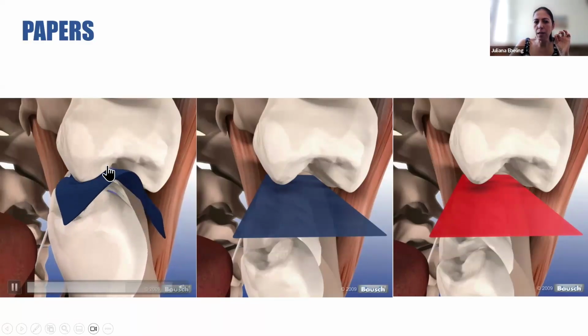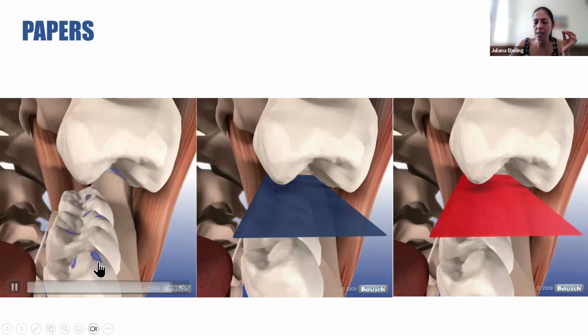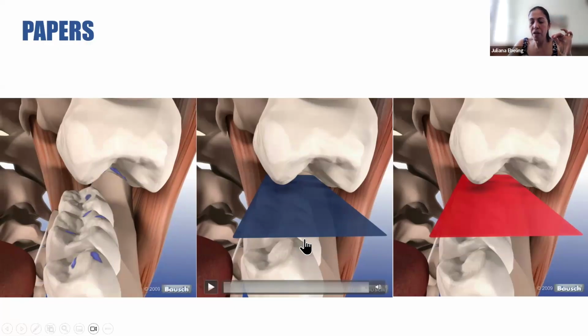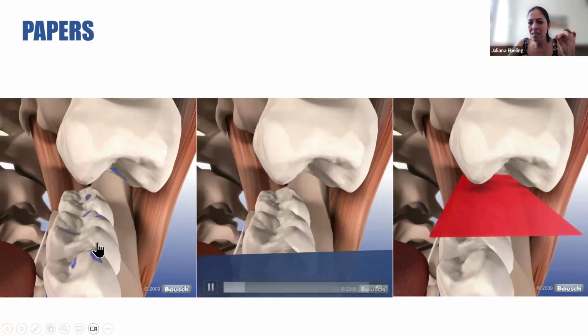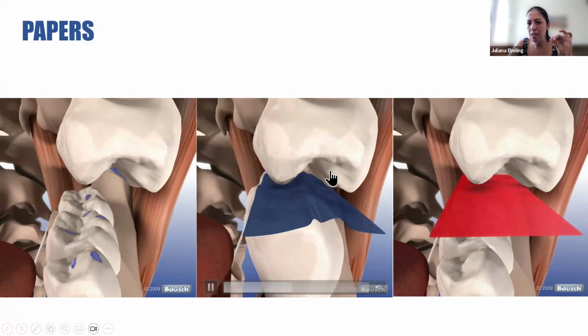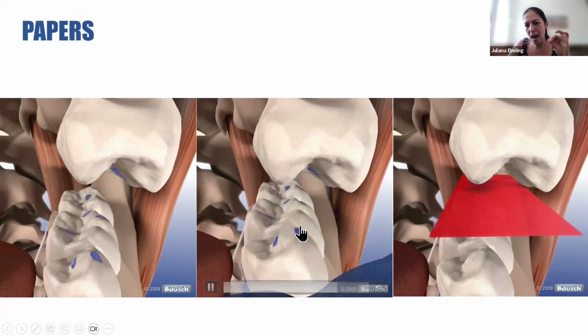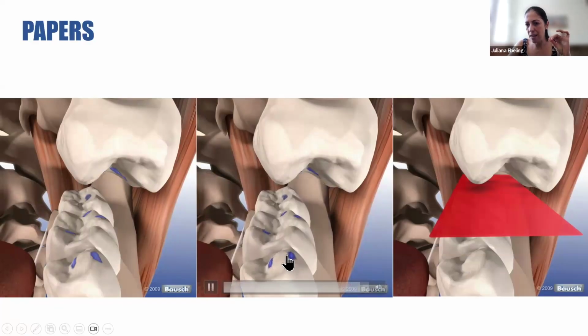We have a glue here that transfers the color, the tint, and we have a larger surface because of the thickness of the paper. Here it's a paper with 100 microns. Look, it's the same occlusion, but the mark is completely different because the thickness of this paper is lower, and then we have a smaller surface.